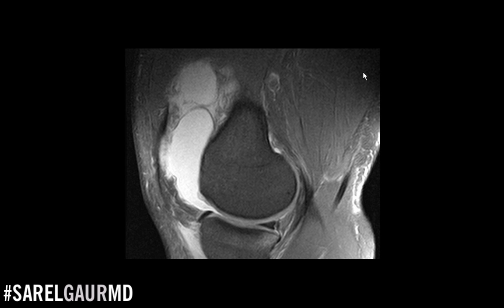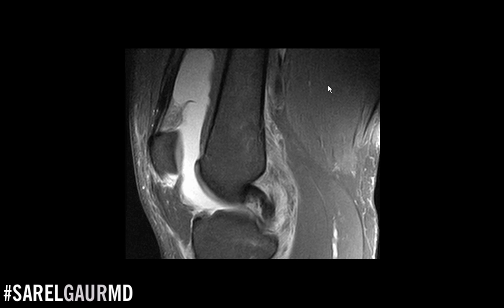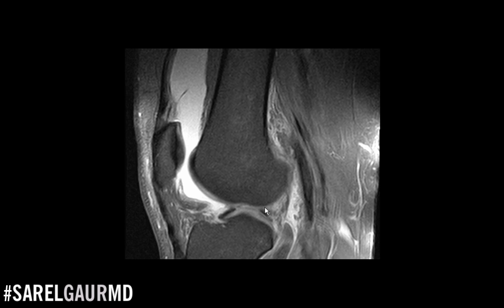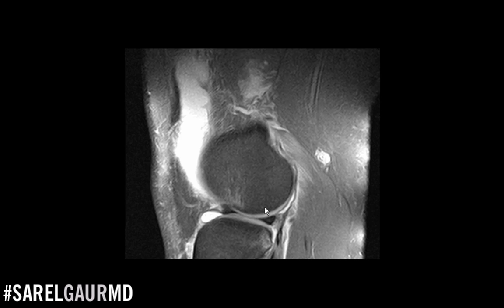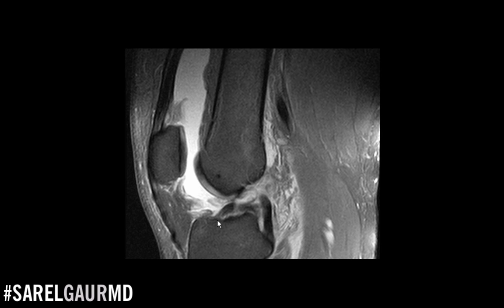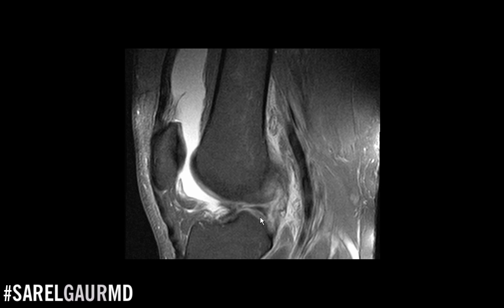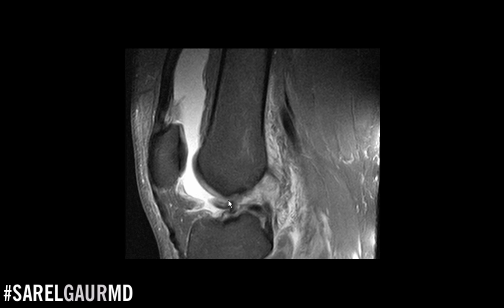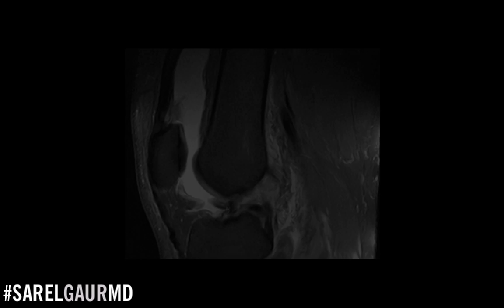This is a patient that presented with pain. As I scroll through, we can see the PCL but just take a look — you cannot see the ACL. Scrolling back into the middle, you can almost see a piece of the ACL here, but basically there's a complete disruption of the ligament. That normal coursing fiber at 45 degrees is just not there. This is an ACL tear. In fact, you can see this folded-up, crinkly thing — that is probably the ACL, completely torn and hanging free inside the joint.